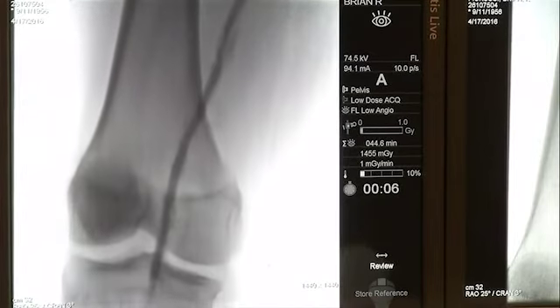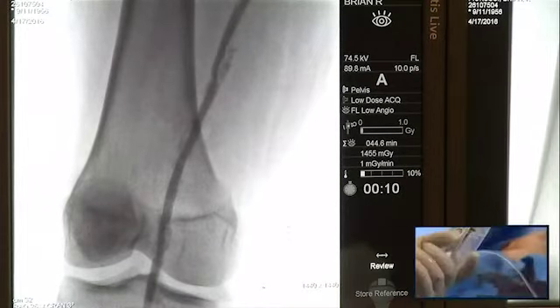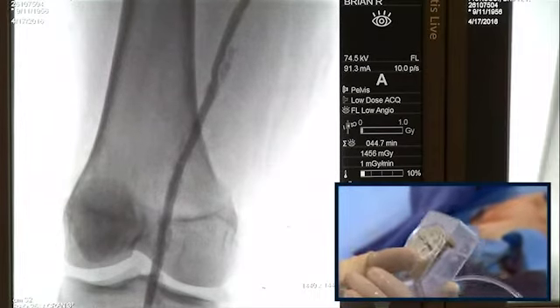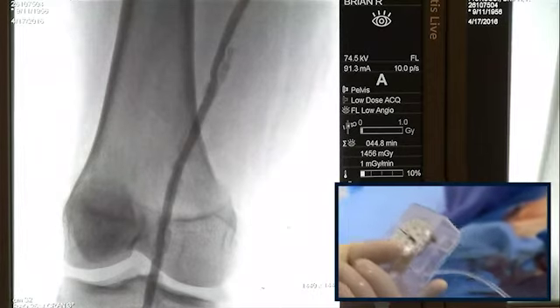I have concerns, as mentioned by Thomas and Andrea and you and others, about the Supera, and sometimes if the vessel is not very well prepped, it can catch, and as you said, unravels the stent. And that area that you can see is a chunk of calcium pushing the artery. We were subintimal. That obviously worries me. That's the area that the balloon ruptured too. But it looks pretty good, except that one area. What do you think, guys?